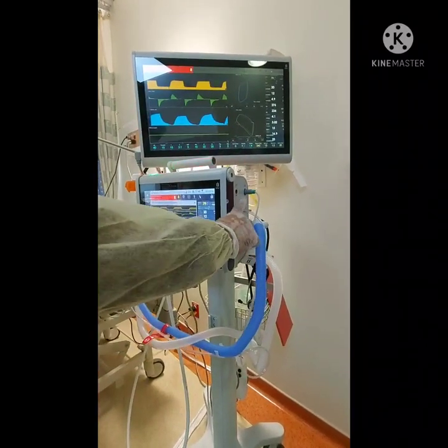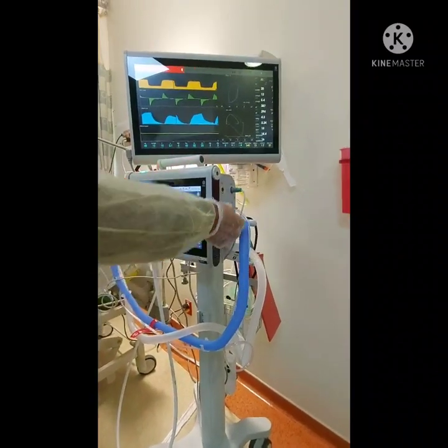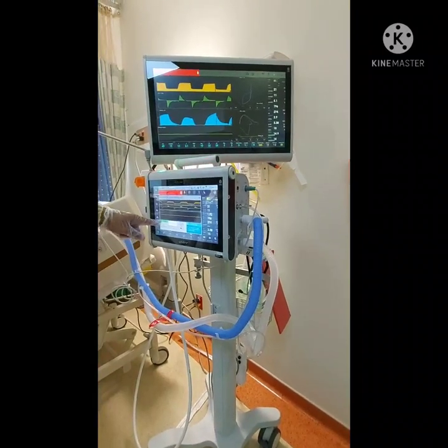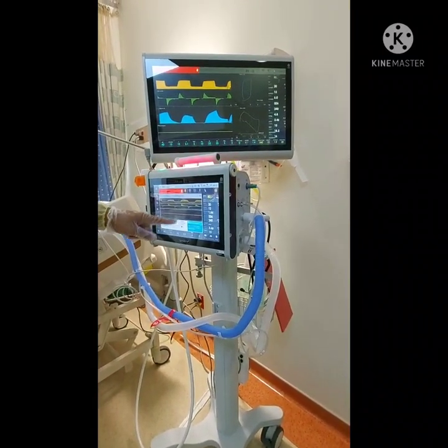So this last one you have to make sure. It should be open and make it zero, then you can connect it. Once you make it zero, it will show success. Okay?